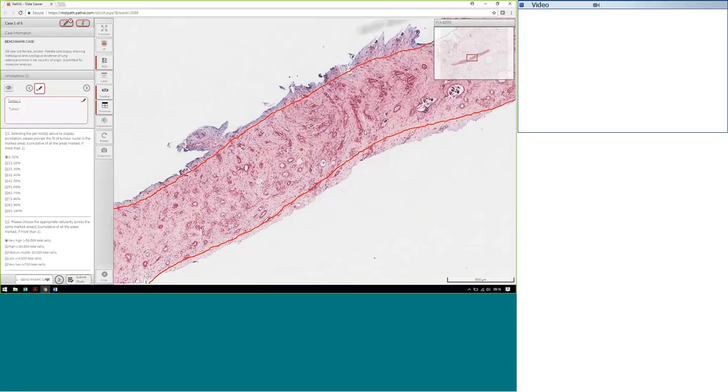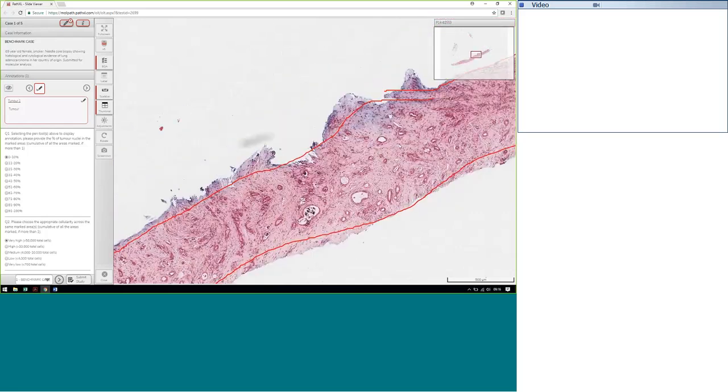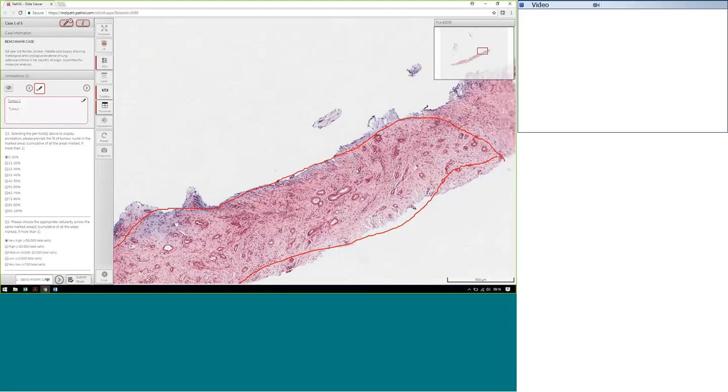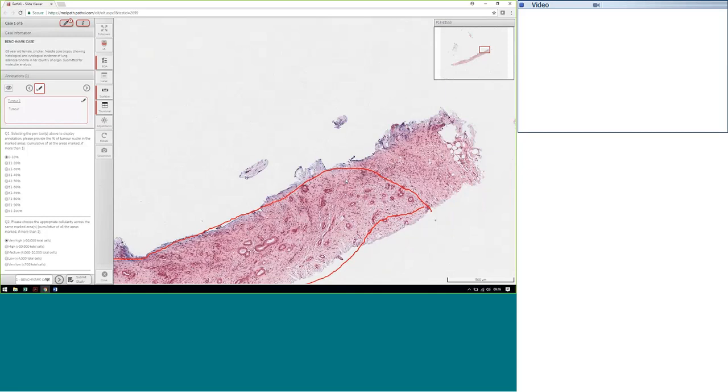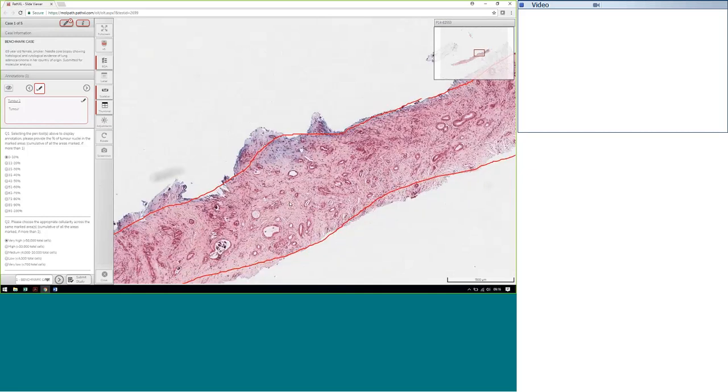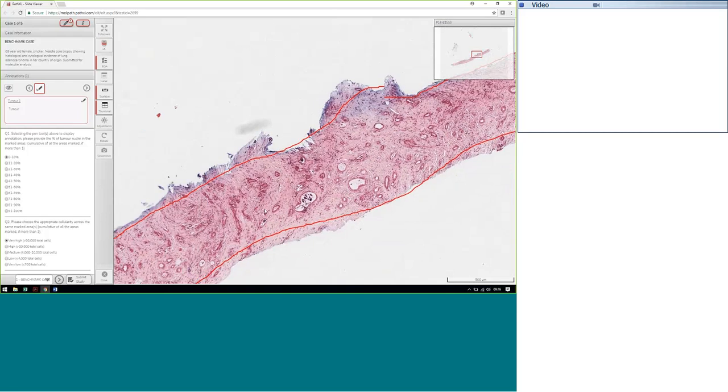Jane, any comments on that? No, I'd agree with that totally, and also the reason it's marked up is because the tumour is so well dispersed throughout, so there's no area to enrich really. And also cutting the ends off looks like it's removing the bulk of the inflammatory response.